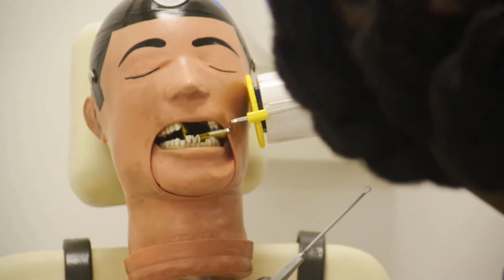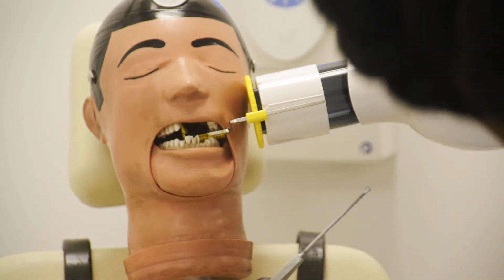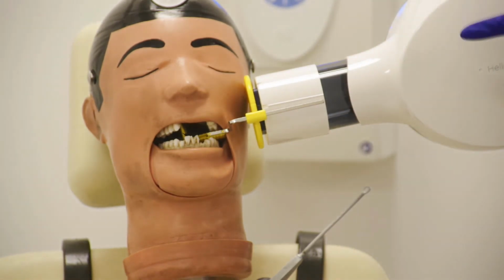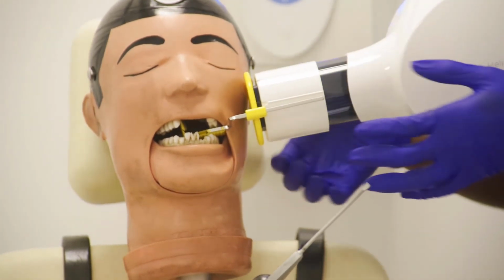Okay. Yes, so I'm just going to adjust it a little bit, and look at it. Yes, so now that looks parallel. I'm going to check here as well, making sure that everything is aligned.